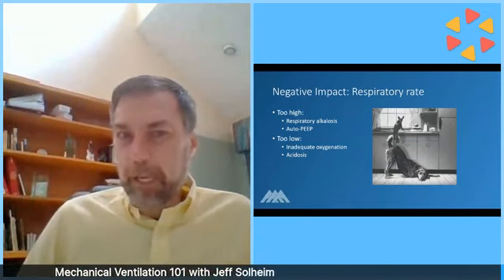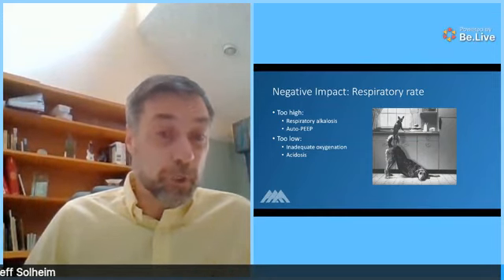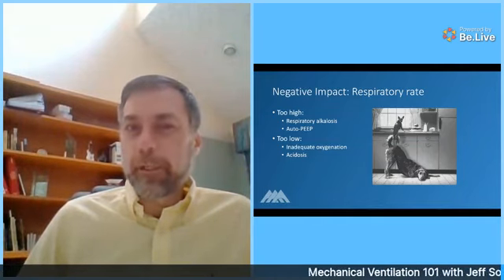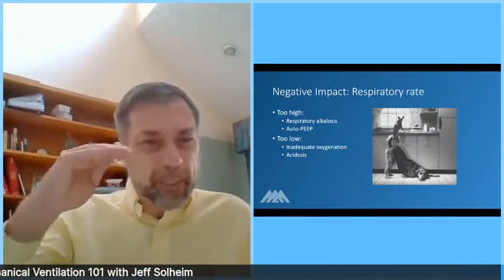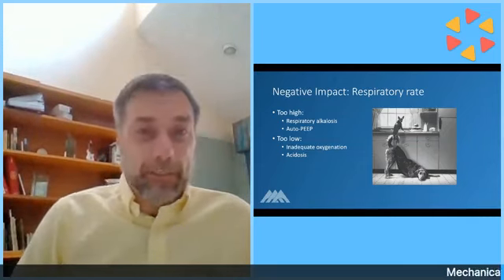If you're not able to do that kind of one-on-one care, and I'm going to guess when the ERs get really busy in the near future, there's not going to be a lot of one-on-one care, you're going to be limited on how high those ventilator rates or respiratory rates can go on the ventilator. So that's kind of the big negative of respiratory rates. You're a bit limited on the paralyzed patient. Hope that makes sense. All right, let's advance.